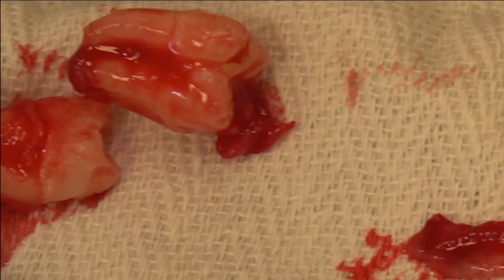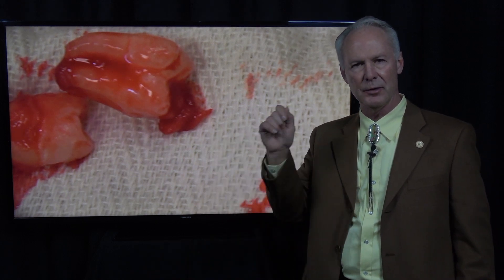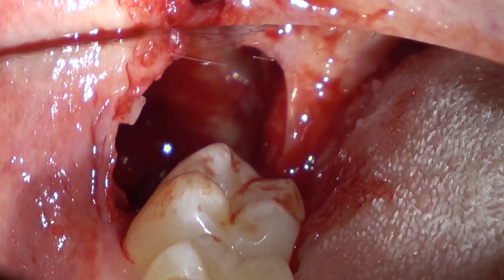Why remove the follicular sac? If you leave it, there's a distant possibility that a dentigerous cyst followed by an ameloblastoma could form. So you want to remove that follicular sac and irrigate the socket very well.